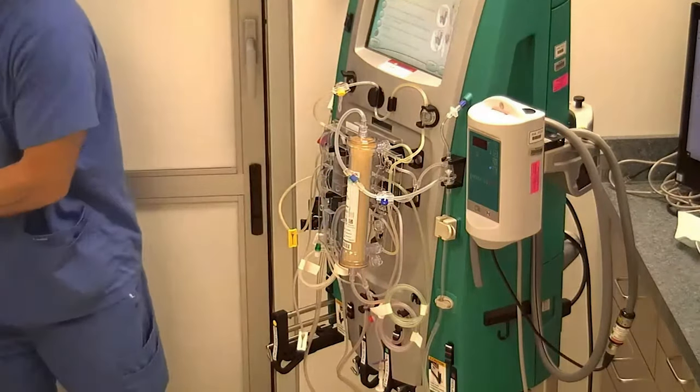This is where the second step is, says connect your access effluent Y line to your priming bag. Now I see what a lot of nurses will make the mistake as soon as they do this on the first set of pictures, they'll spike their saline bag, and that's a big mistake because if you get fluid into your tubing, this machine has to do several pressure tests, and if there's any type of solution in there, your set will fail. So that's where I see a lot of failures during the priming process. So this is where we're actually going to spike our first bag of saline.